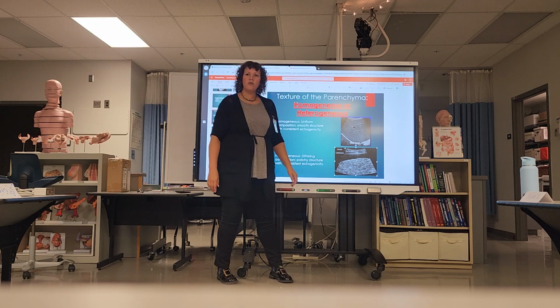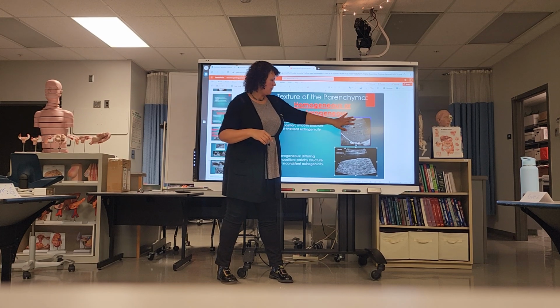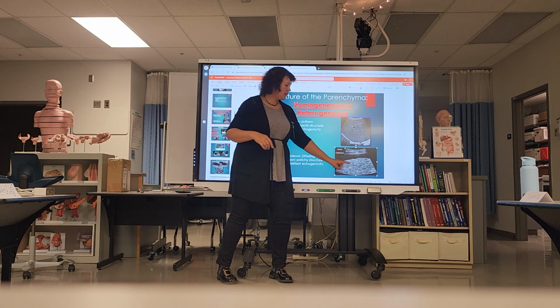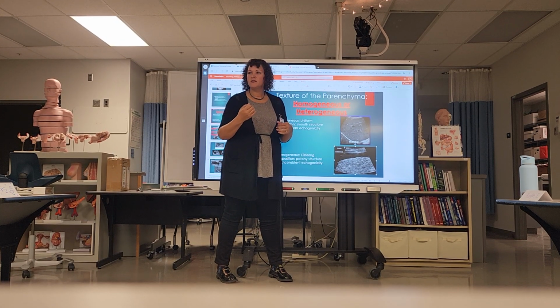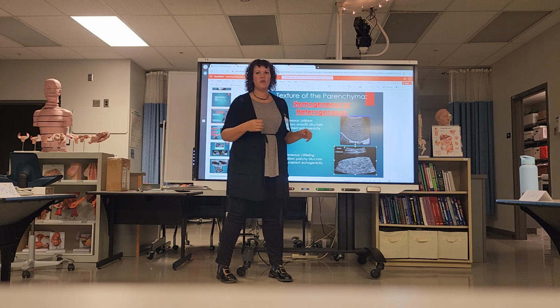So looking at liver tissue can be really tough to distinguish between a normal, smooth, homogeneous liver or a really coarsened liver. This is obvious. Sometimes you'll have patients that have elevated liver enzymes just slightly, and their liver might just slightly be coarse.